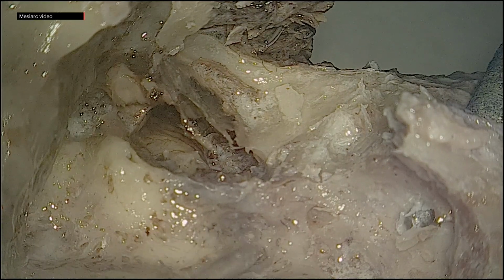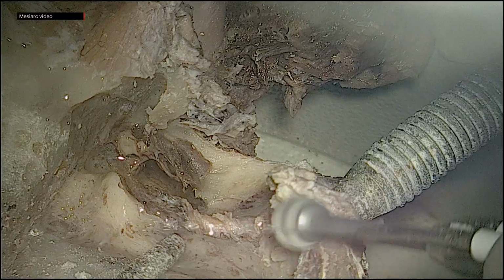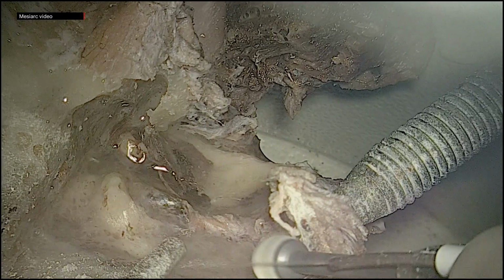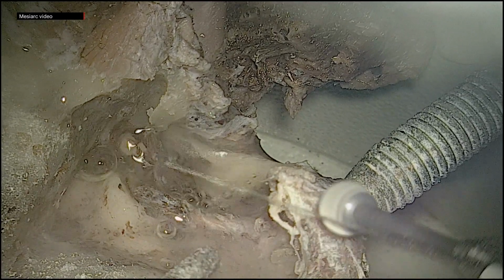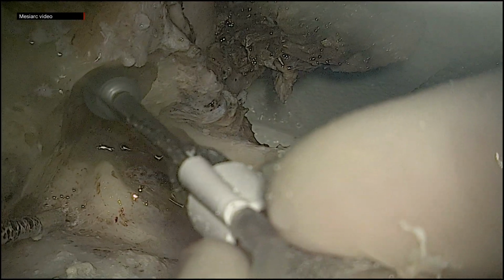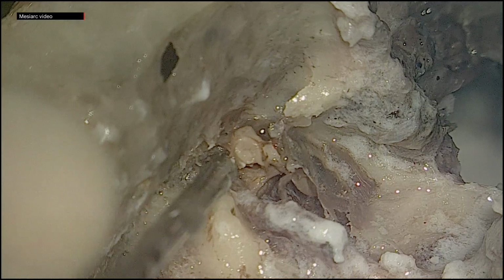Now you can all see the incus and the stapes are already removed. The malleus head is present. The floor of the external auditory canal is now made flush with that of the posterior canal wall. The same is done to the scutum to make sure that there is a slope that extends into the attic.